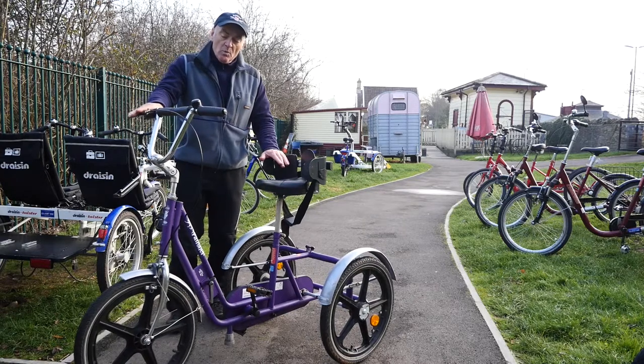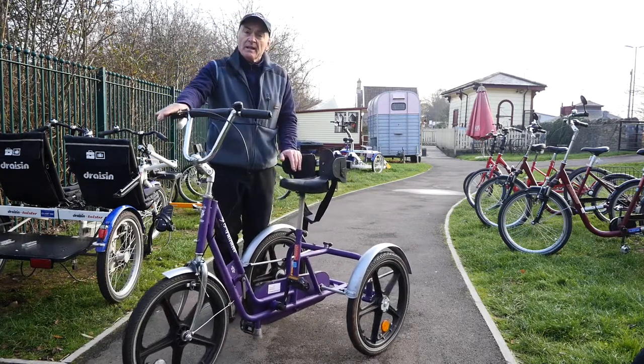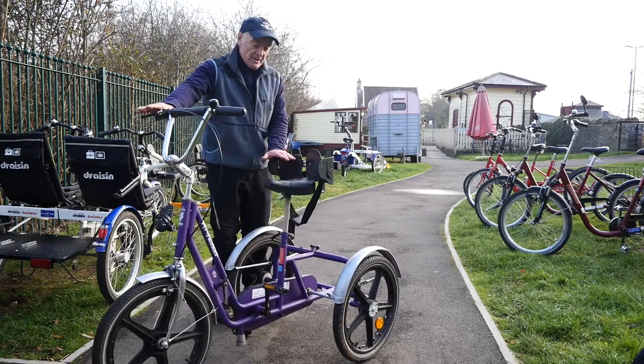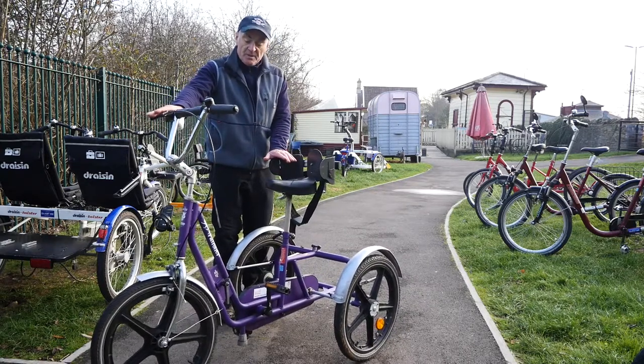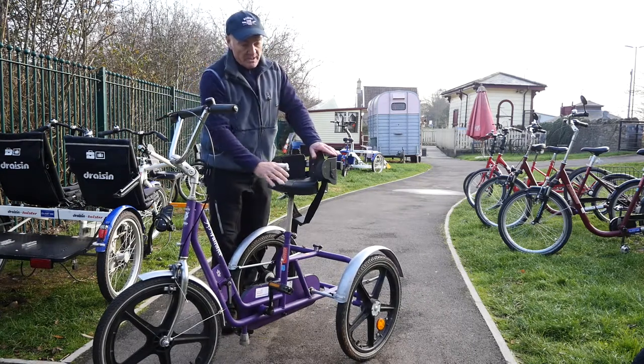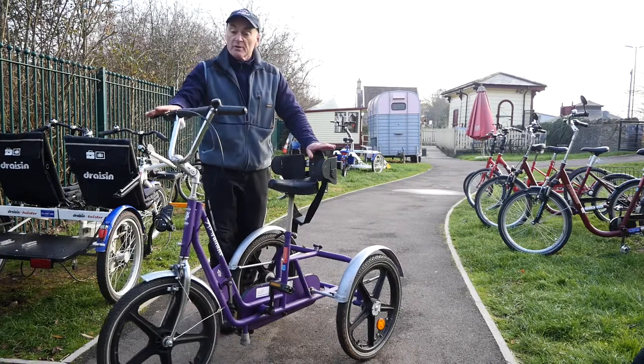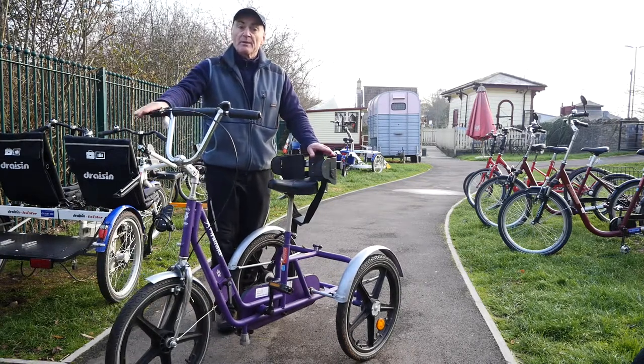It's for people with limited capacity who want some kind of independence. It doesn't go too fast and it's nice and stable. It fits me and people taller than me. If you're large in girth the seat belt won't actually work, but most people that use this are actually self-supporting. So that's the Purple Panther.